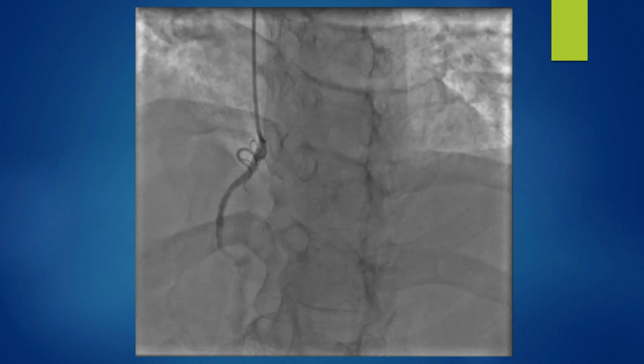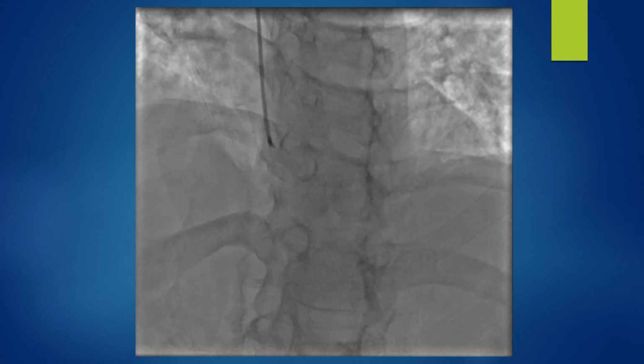The RCA had mild disease in the mid to distal segment.